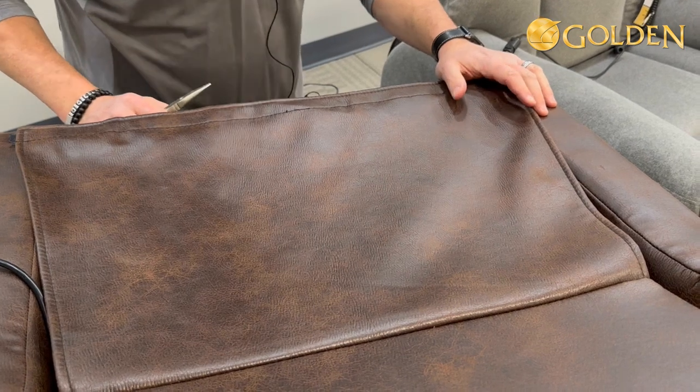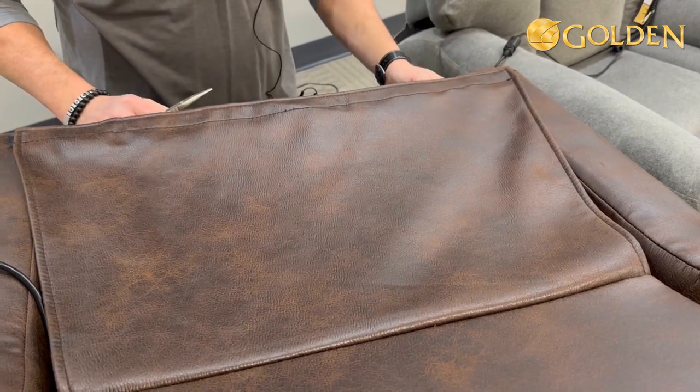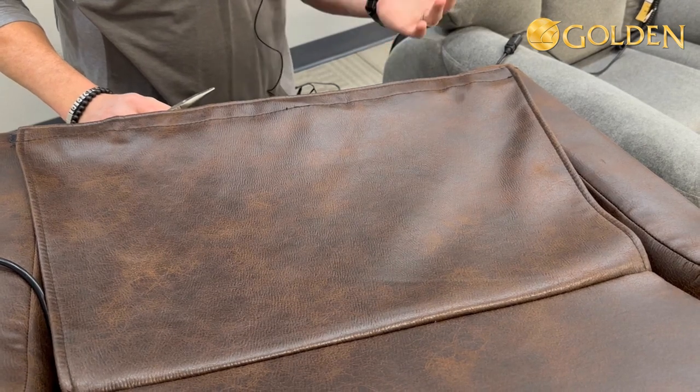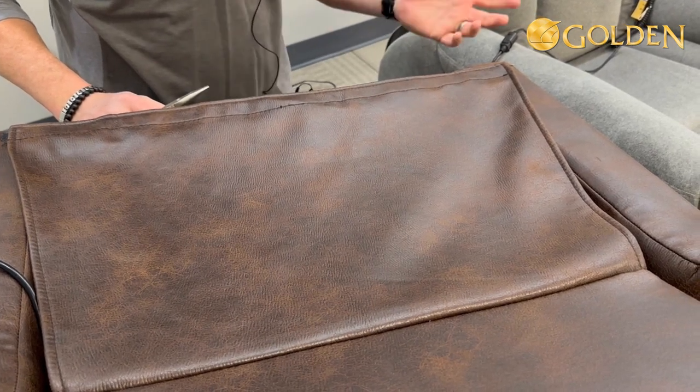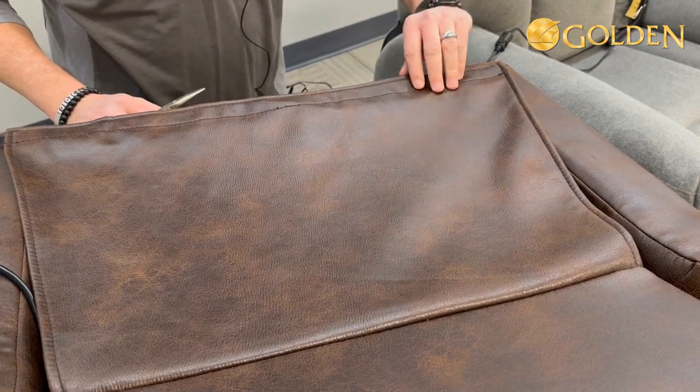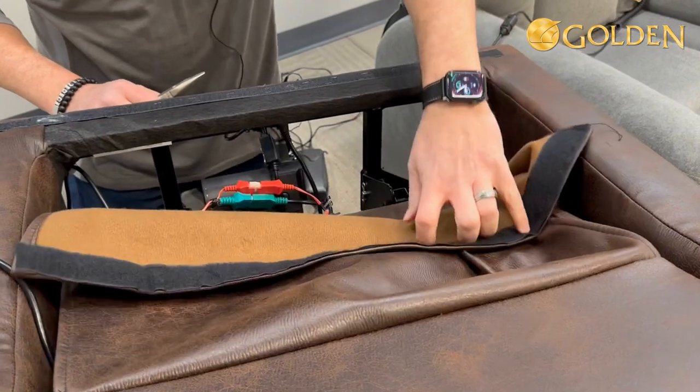Today we're going to change the lift angle on the lift chair from an arced lift to a straight lift. In order to do that, you want to position the chair properly - it's easiest to flip it forward on its chase pad and lift up the curtain here so you get some light.